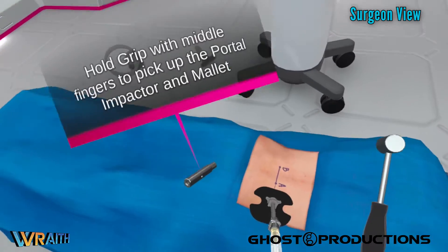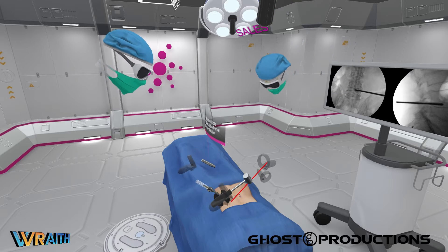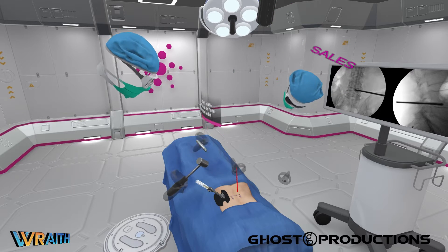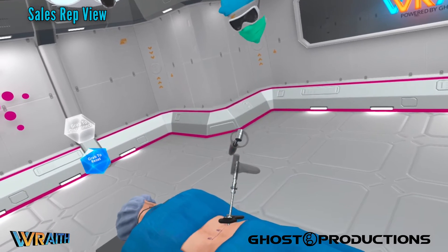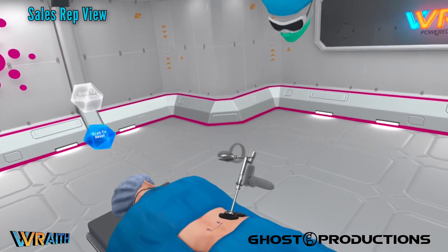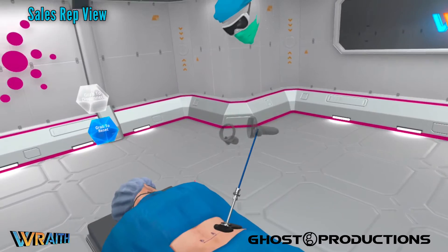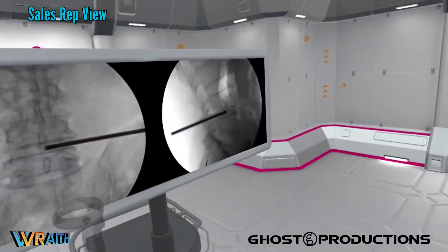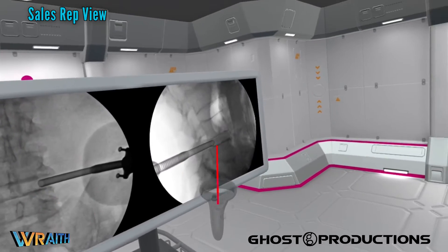The tool is also adjustable at that depth stop to make sure any tools used with it can't go any deeper into the disc space. So everything now is going to be stopped by the portal for the positive stop. That's correct. You can remove the blue dilator now, and we'll confirm the placement of the portal. That looks good.